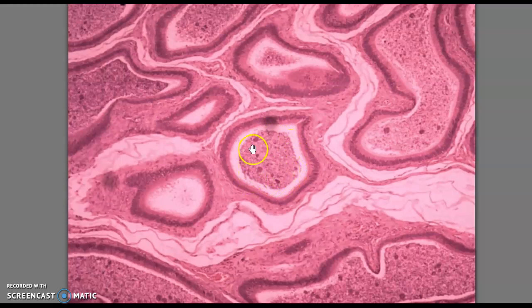And you could always tell it's the epididymis because there's this border here. They don't seem to like to hang out around the edges, and I'll explain why on the high power. So we have this pseudostratified columnar epithelium. And on the outside of it is smooth muscle, because that's going to propel the sperm through with peristaltic contractions. Then we have connective tissue on the outside.